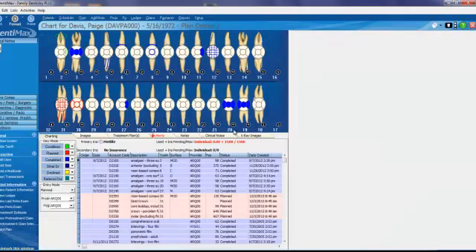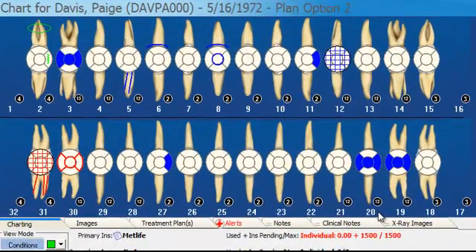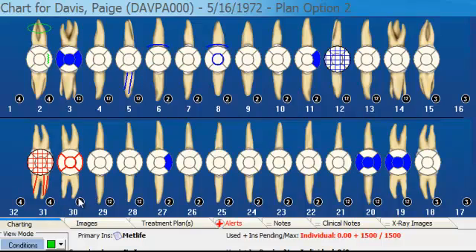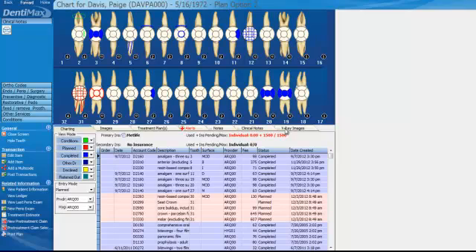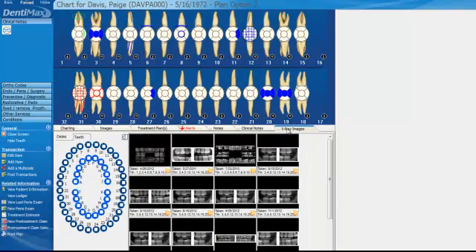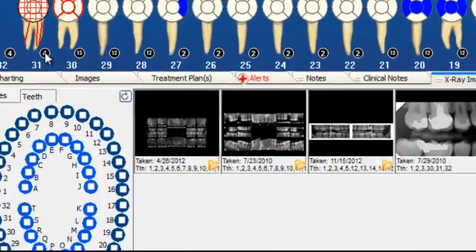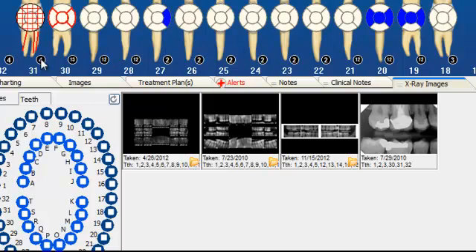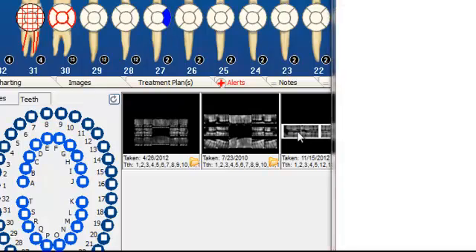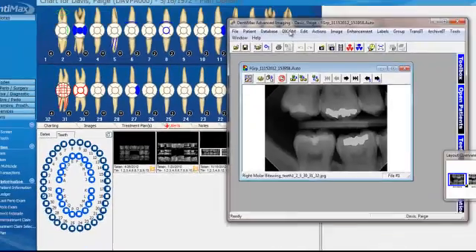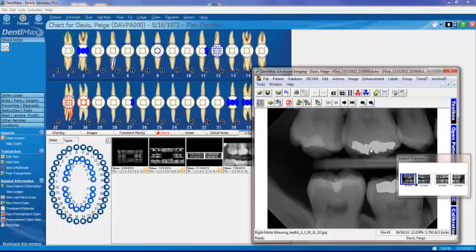From here, you'll note that we changed the screen colors in the charting screen, but you'll also note that I have numbers under each of the teeth. I'm going to click on X-ray images, a new tab here at the bottom. We've got a lot of x-rays for Paige Davis. I'll click on the four on tooth number 31. When I do that, there are four x-rays that correspond to tooth number 31. So by clicking on it, I immediately can see the four x-rays. If I double-click on one of those, it'll pull up my full imaging software so I can further analyze that x-ray.